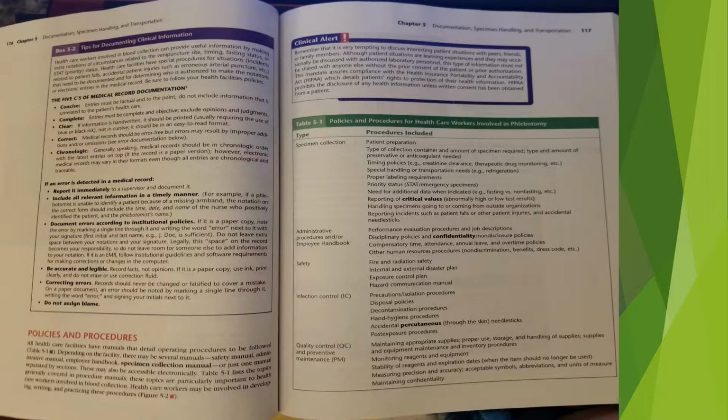Type of policy: specimen collection. Procedures included are patient preparation, type of collection container and amount of specimen required, type and amount of preservative or anticoagulant needed, timing policies such as creatinine clearance, therapeutic drug monitoring, etc., special handling or transportation needs such as refrigeration, proper labeling requirements, priority status such as STAT, emergency specimens, need for additional data when indicated such as fasting versus non-fasting, etc., reporting of critical values, abnormally high or low test results, handling specimens going to or coming from outside organizations, reported incidents such as patient falls or other patient injuries and accidental needle sticks.